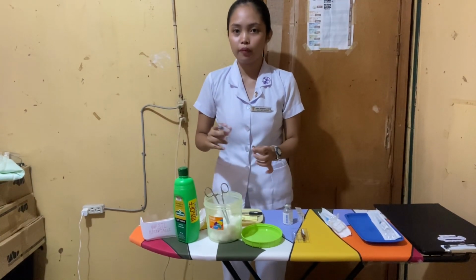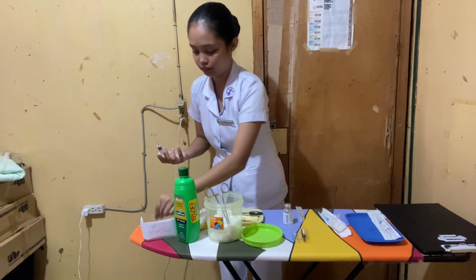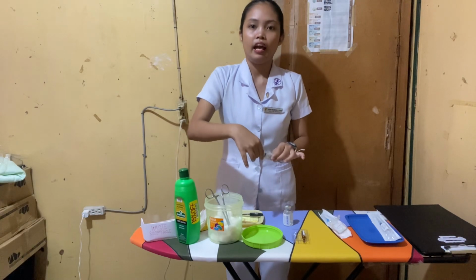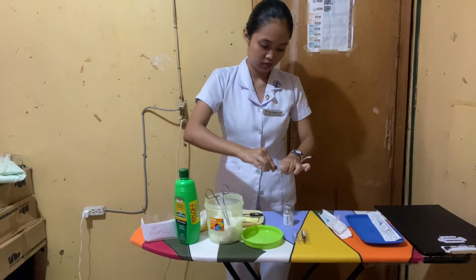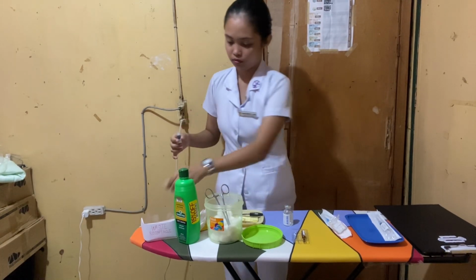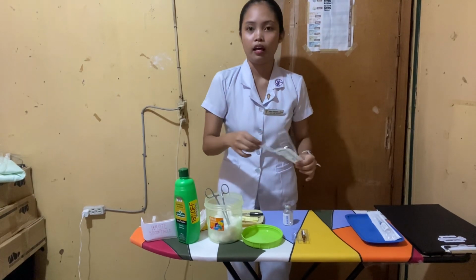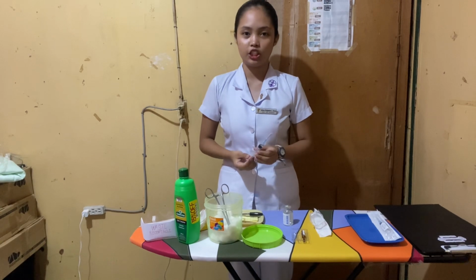Now I'm going to recap the needle and take off the aspirating needle and discard it. And connect the syringe to the right size needle. I'm going to place this into a hypodermic tray and then write the medication ticket.